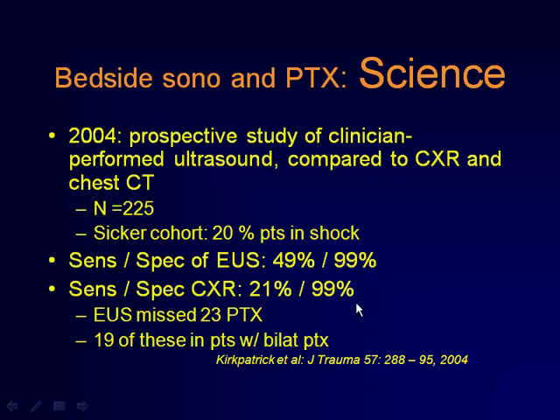Other studies have since then shown that this high degree of accuracy has not been borne out in most people's clinical practice. In this large series done by Dr. Kirkpatrick in 2004, there was a sensitivity and specificity of about 50 and 100%.